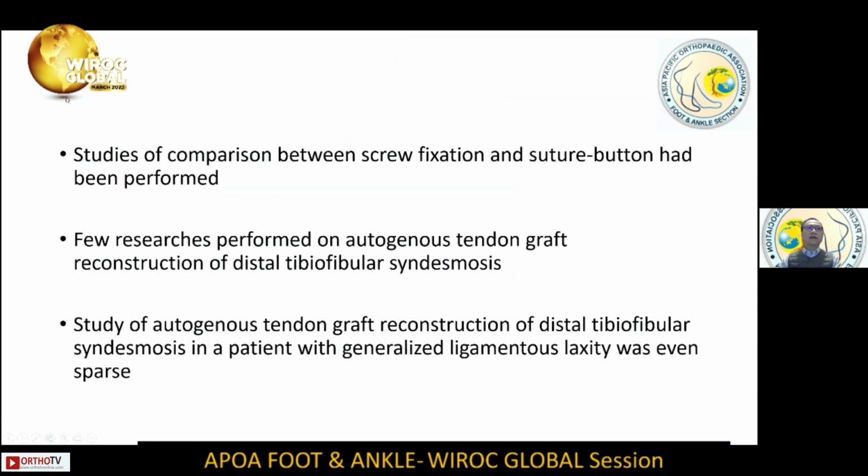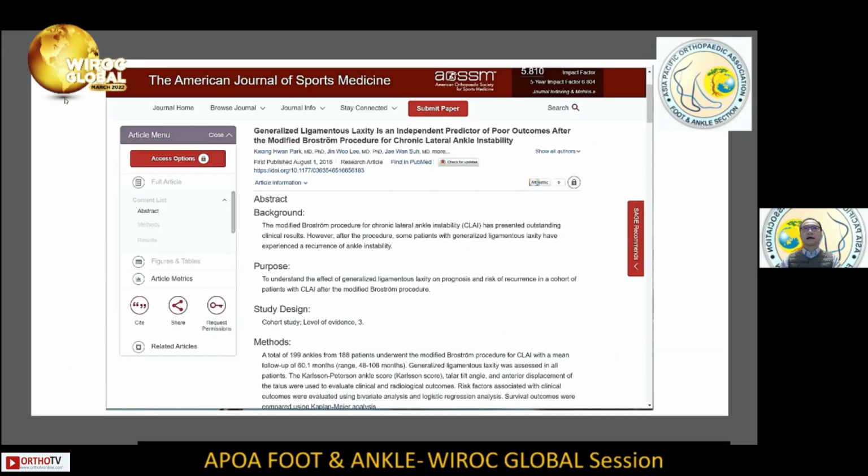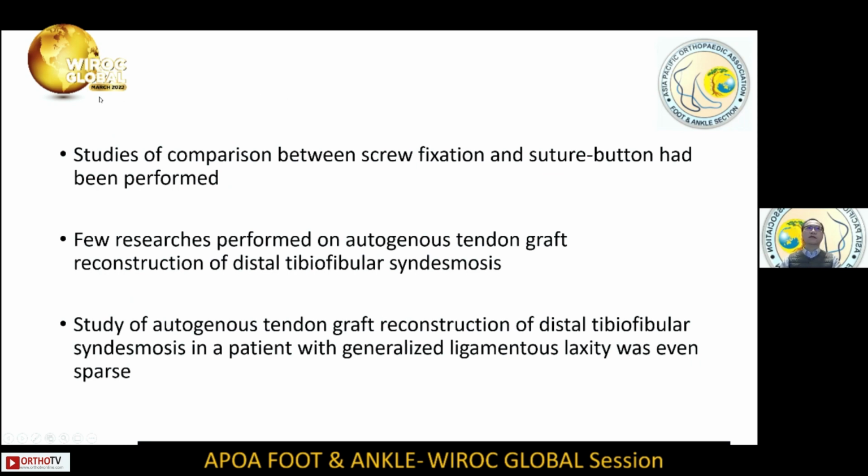Well, there has been comparison of the fixation of the distal tibiofibular syndesmosis with screw or suture button. However, there is not much research on autologous tendon graft reconstruction for distal tibiofibular syndesmosis injuries.